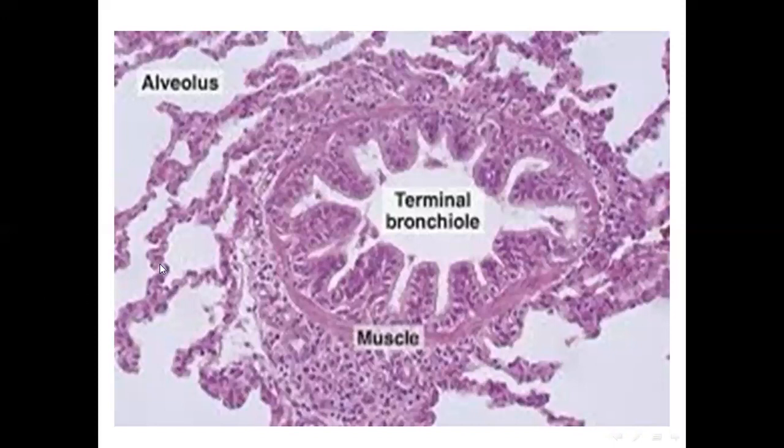There the lamina propria had glands and cartilage, which are interrupted cartilage plates, while here we cannot find either glands or cartilage. Also, we can find smooth muscle layers, in addition to the different lining epithelium.